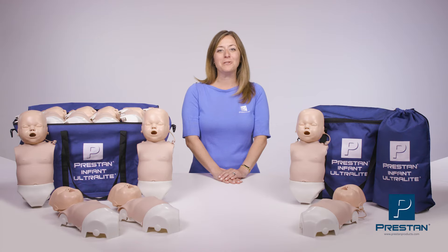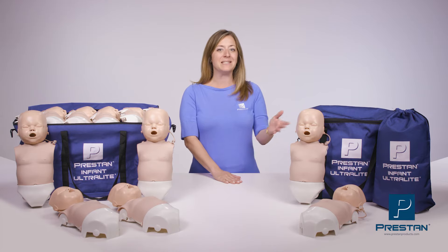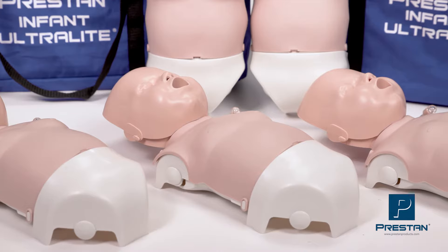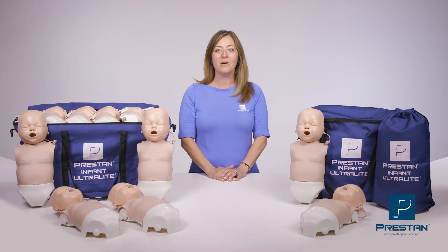The Prestan Infant Ultralite Manikin is available in both medium or dark skin tones, and in a single, 4-pack, or 12-pack. Diversity and specialty kits are also available. To learn more about the Prestan Infant Ultralite, please visit PrestanProducts.com or contact your Prestan authorized distributor today.